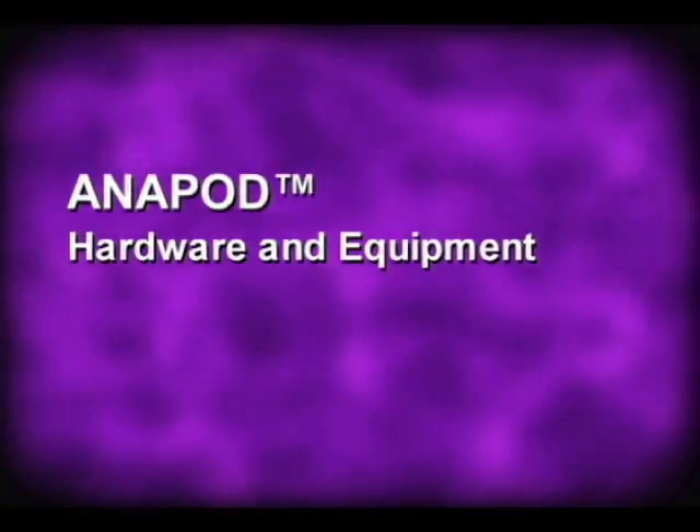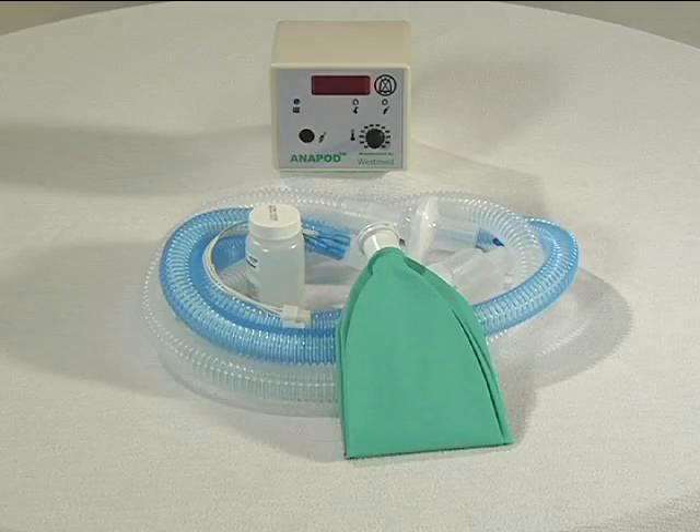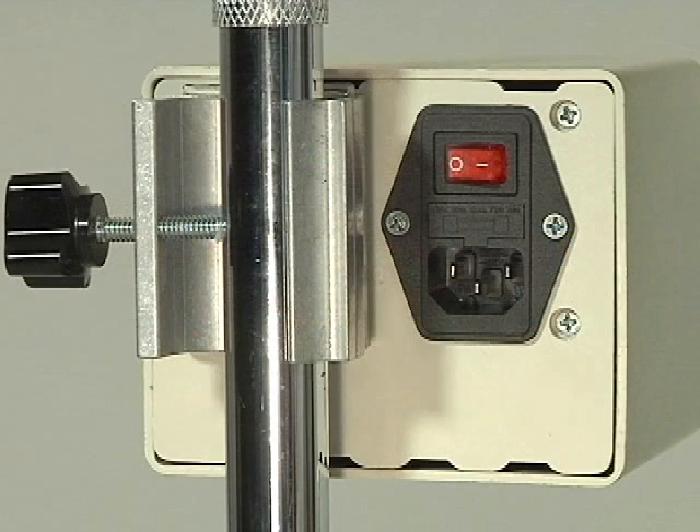Anapod hardware and equipment. The Anapod humidification system consists of the Anapod controller, heated wick circuit, power and controller cable, and pole mount bracket. The controller is attached to an IV pole with a pole mount bracket.